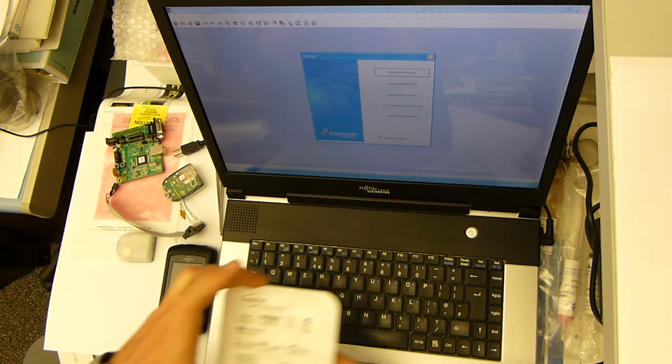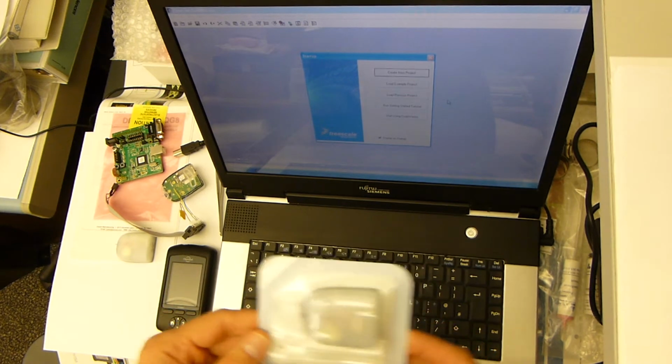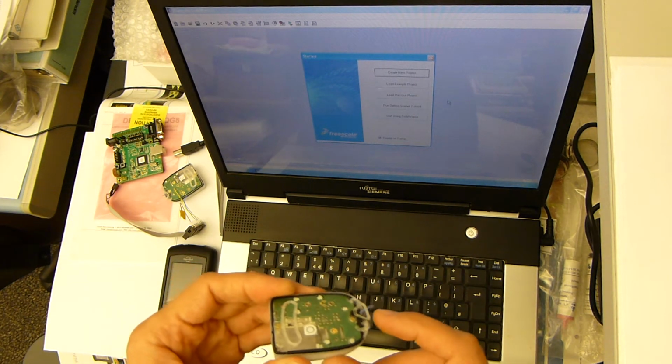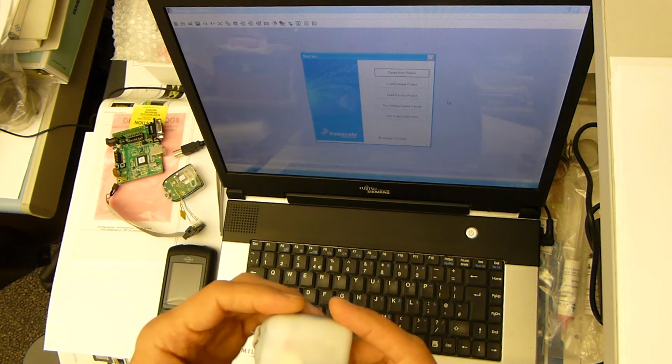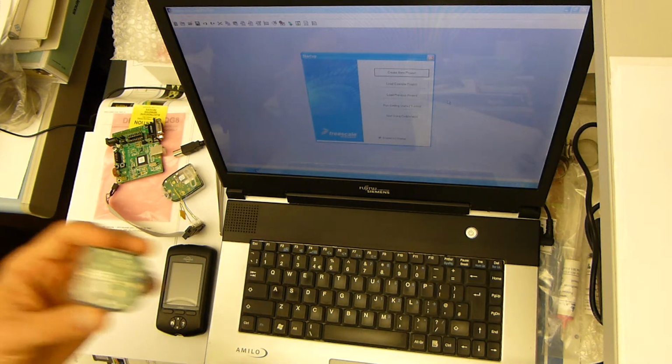So here is what the Omnipod new pod looks like, and here's what a used pod looks like. You can still see the cannula sticking out, and the pod doesn't communicate with the PDM controller after it has been used.